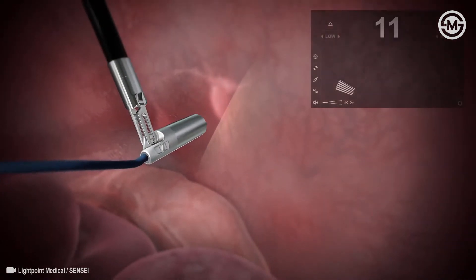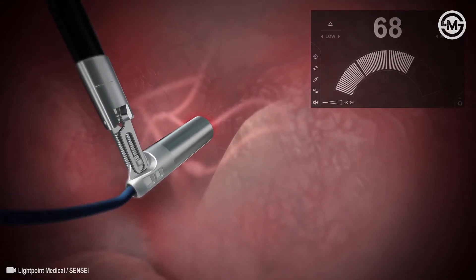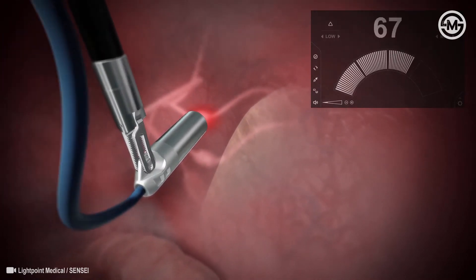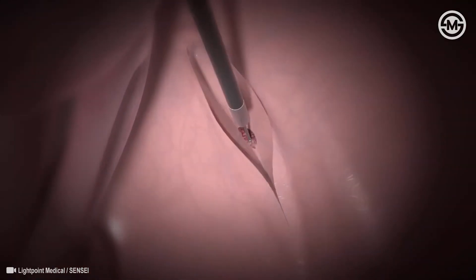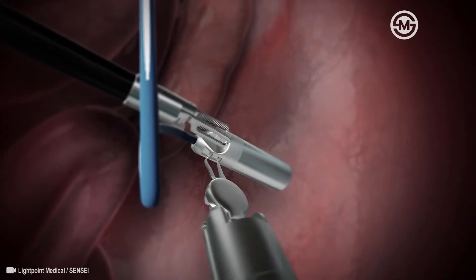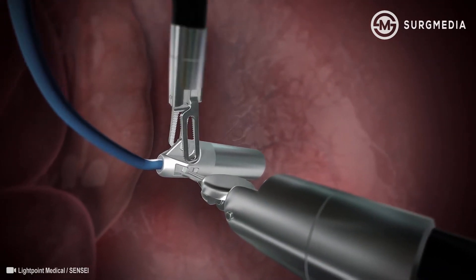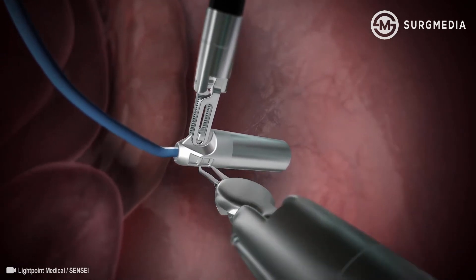Sensei is then inserted into the patient using a standard laparoscopic port and maneuvered by tissue graspers to scan inside the patient. When scanning tissue, the console provides audio feedback to the surgeon. This feedback helps the surgeon to locate specifically where the cancer is in real time. Cancer can then be removed and healthy tissue retained.